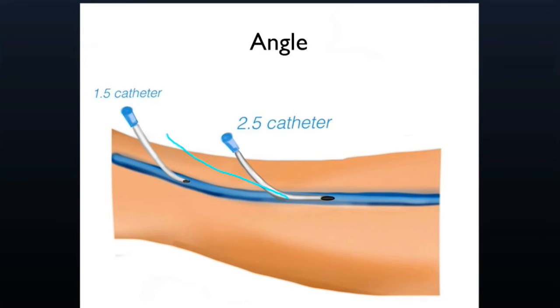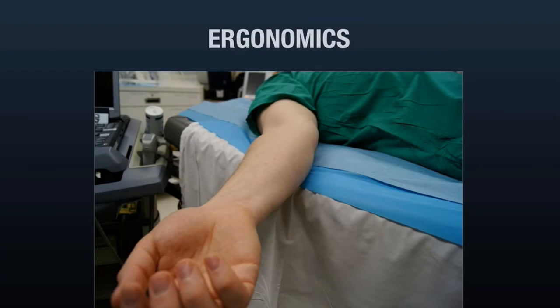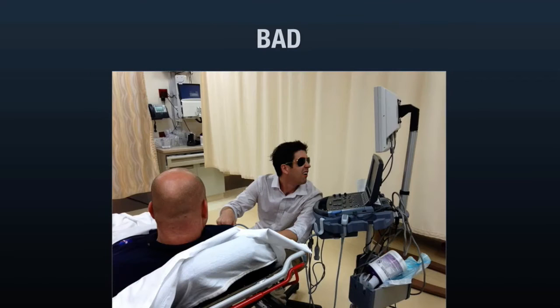You're not going to have much left in the actual vein. So you have to take a little steeper angle, and then you can flatten out once you actually get to the vein and thread the catheter. But by taking a steeper angle, you don't use all of your catheter up in the tissue before you get there. You really have to set up well beforehand to maximize your chances for success.